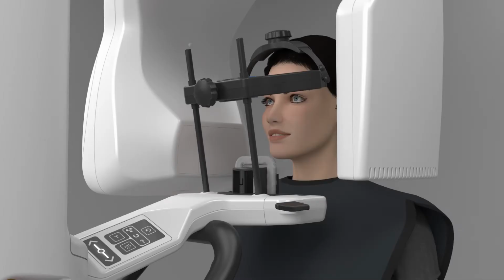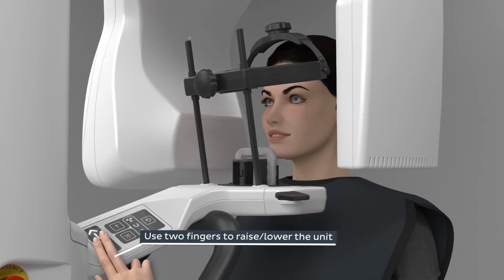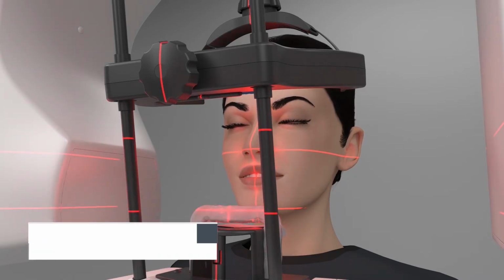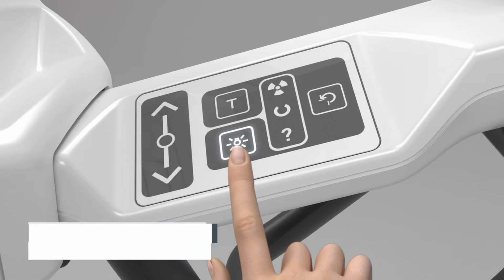Have the patient stand in front of the unit and instruct them to stand as straight and tall as possible. Raise or lower the unit as needed so the patient's chin is level with the chin rest. Tell the patient to close their eyes so you can use the alignment lights to ensure that the patient's occlusal plane is horizontal prior to entry. To turn the patient positioning lights on, press the positioning light button on the control panel.